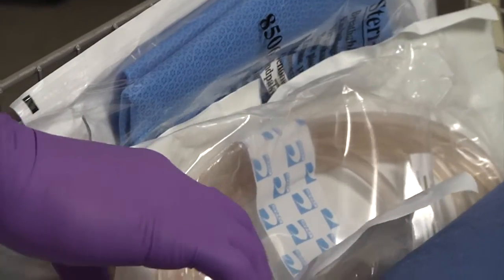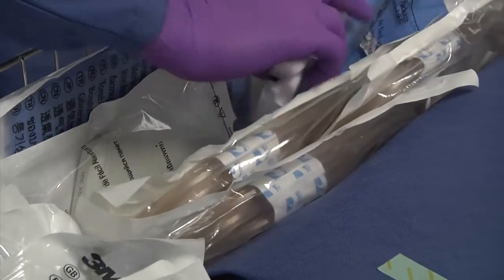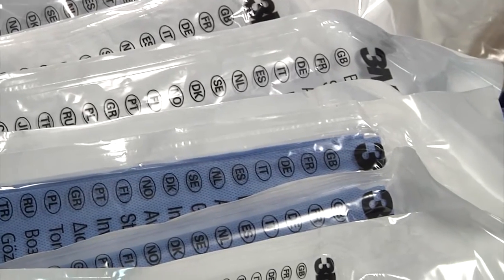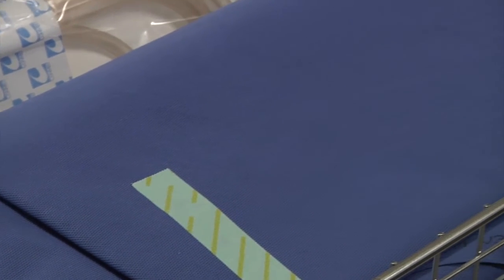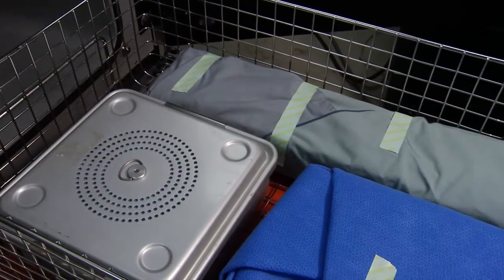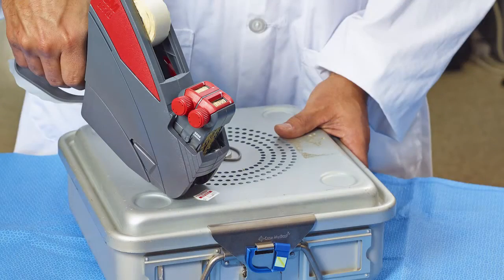When using sterilization pouches, make sure the 3M Comply chemical indicator strip for EO is visible from outside the pouch. Seal sterilization pouches using a heat sealer set to the appropriate time and temperature. Secure wrap trays with 3M Comply indicator tape for ethylene oxide. For rigid containers, ensure that the external EO process indicator is somewhere on the outside of the container. Be sure to attach a 3M Comply load label per your facility's policies to each package prior to loading the packages into the sterilizer basket.